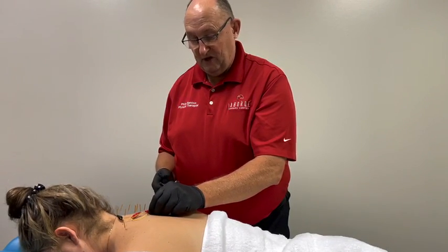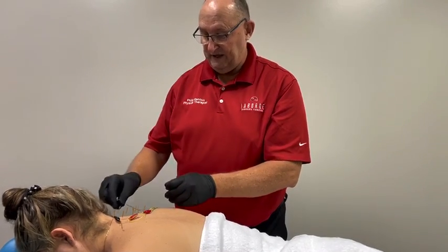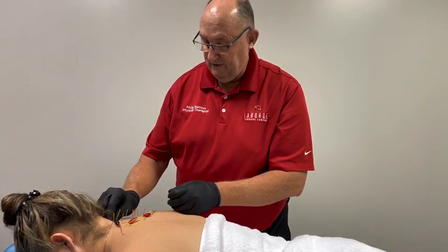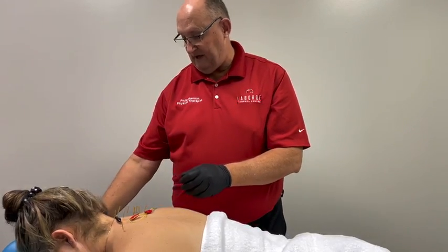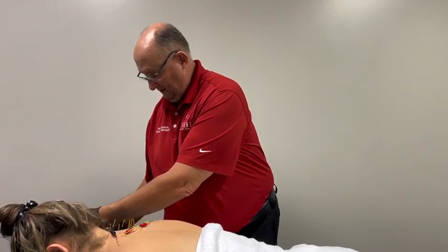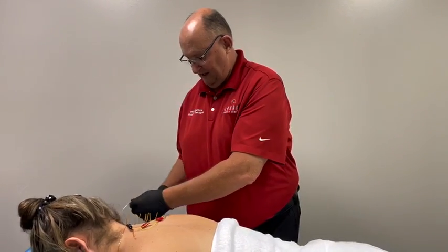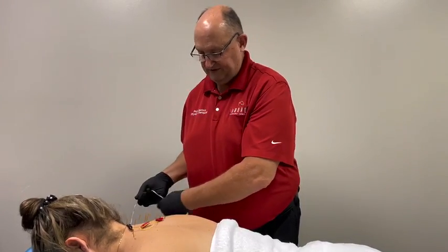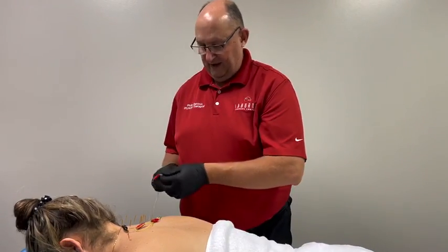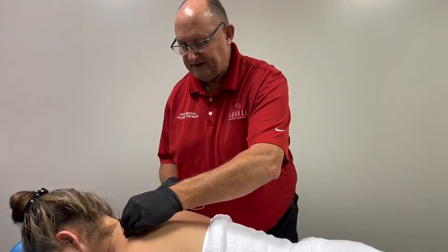So a lot of people come in, they're say an 8 out of 10 pain-wise, and then they undergo dry needling, and on a good result, the next day they might be a 2 out of 10. They're going to be sore like they worked out, went to the gym and worked out those muscles, because those muscles are going to be worked with the stimulation I'm putting on. And that's why I'm doing the upper trap, to show you how it actually makes the muscle flex.